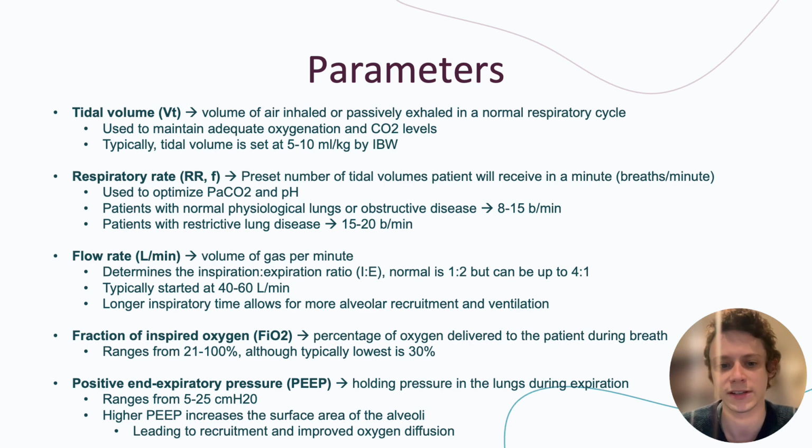Your tidal volume is the volume of air inhaled or passively exhaled in a normal respiratory cycle. You can just think of it as basically the volume of air going in during each breath. It's used to maintain adequate oxygenation and CO2 levels. Typically, a tidal volume is set at around 5 to 10 milliliters per kilogram of ideal body weight. You'll typically see tidal volumes of around 400 to 700 mL or so.